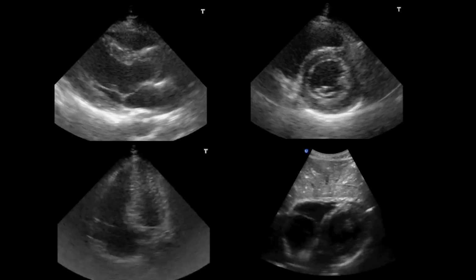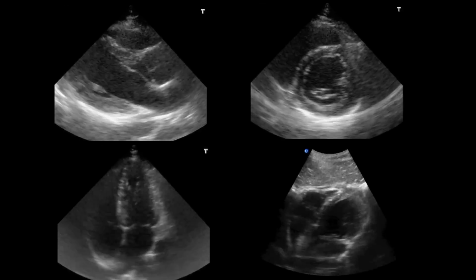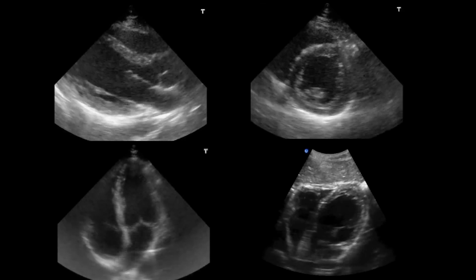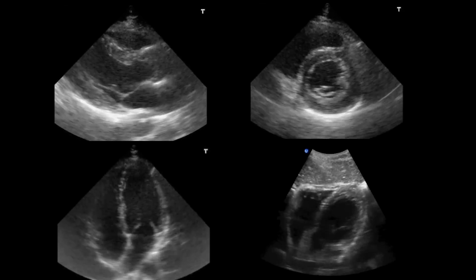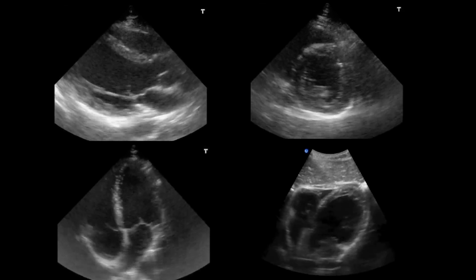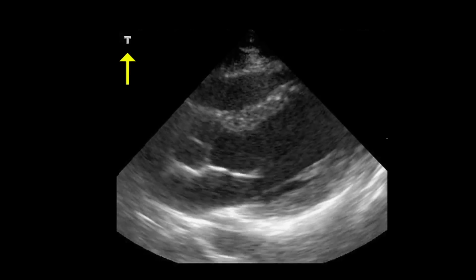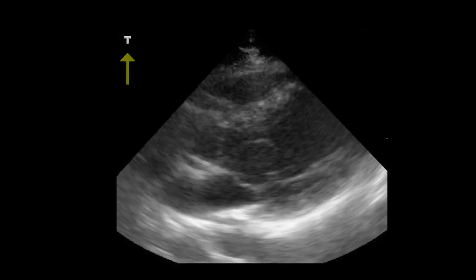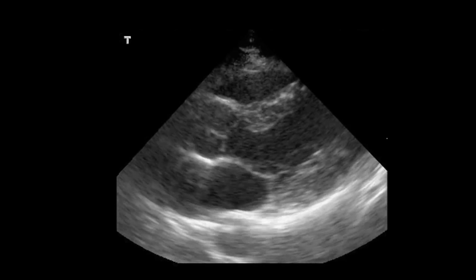By simply memorizing what the standard cardiac views look like on the ultrasound monitor, you can avoid confusion about which side of the monitor the marker dot correlates with. Novices can start using echocardiography by learning only 4 or 5 standard views. If the marker dot is oriented to the left of the monitor, as in the abdominal setting, cardiac images will be reversed 180 degrees on the monitor.